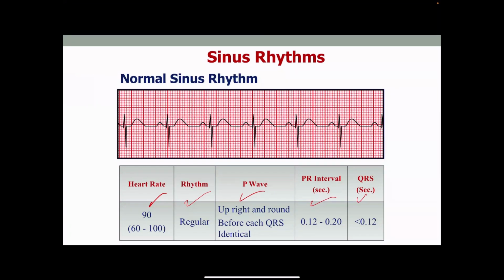And be careful, in the exam, they do get you an ECG and you have to know it's normal, because they really care about in third year for you to be able to tell what's normal from what's not normal, more than diagnosing complicated things and knowing ECG so well. So at your level, it's really important that we know the difference between normal and not normal. So expect this on the exam and don't hesitate to choose normal.